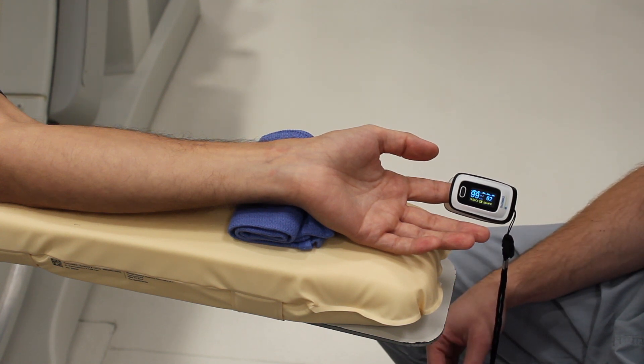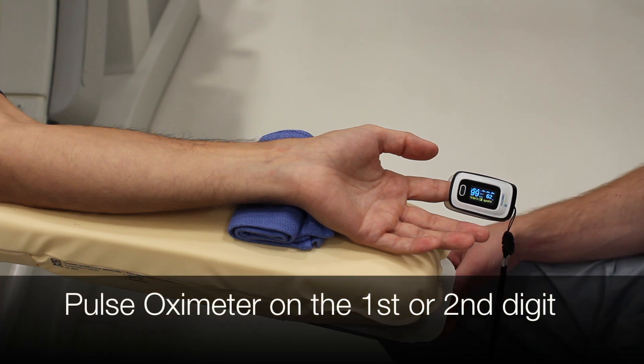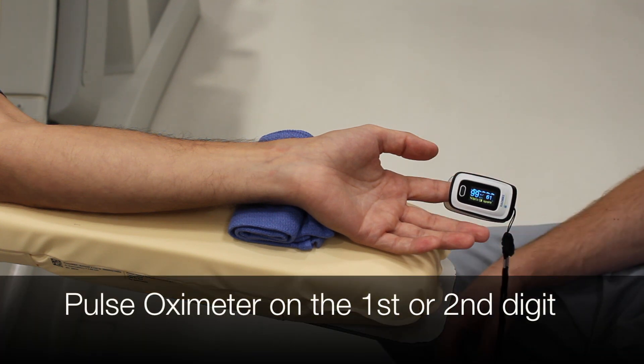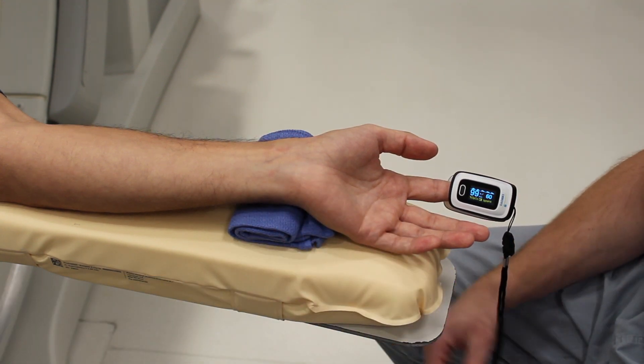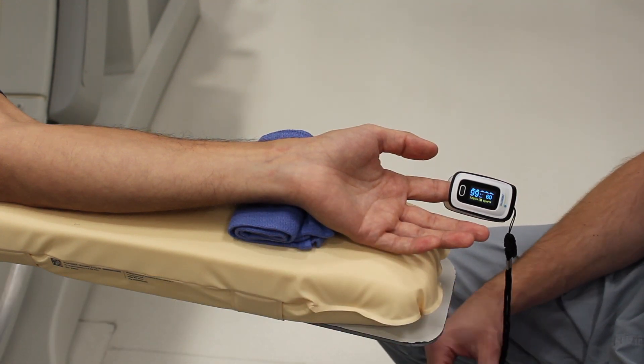Basically, what you'll do is put a pulse ox onto the index finger or the thumb, then compress the radial artery and the ulnar artery at the same time, and then release the ulnar artery to see if you have dual perfusion to the hand.